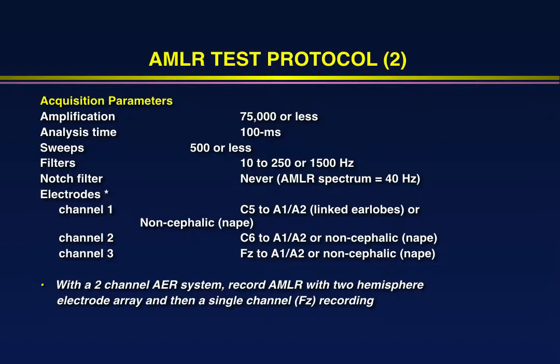You can figure that out. Each of the major positive peaks is 25 milliseconds apart. So if something is 25 milliseconds apart and it keeps happening over and over, it's happening 40 times a second. So we know there's energy at 40 hertz.